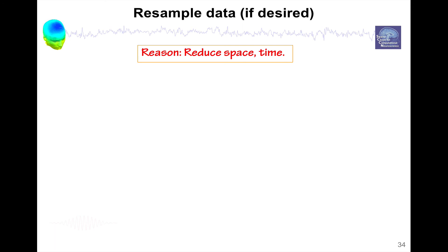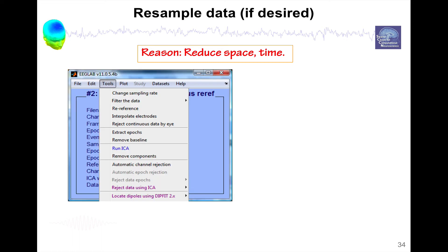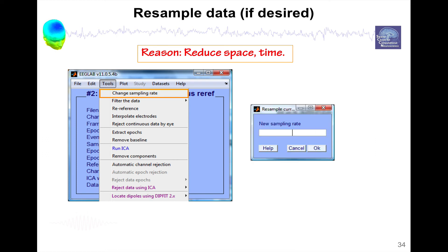The next step is to resample the data if desired. The main reason is to reduce disk space and processing time — for instance your amplifier might collect data at 2 kHz and you don't need that time resolution for processing. You would go to Tools > Change Sampling Rate and select a new sampling rate, for instance 256 Hz. Importantly, when you change the sampling rate EEGLAB will automatically low-pass filter the data at half the new sampling rate — so if you resample to 256 Hz it will low-pass filter at 128 Hz.